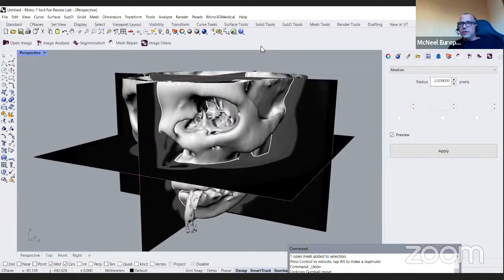More questions. This one is more about the algorithm you use to create the mesh. Lord Pompillordo asks if you can share any details about the mesh process, that is, if you are converting the image to voxels and then smoothing the surface of a collection of voxels. Yeah.